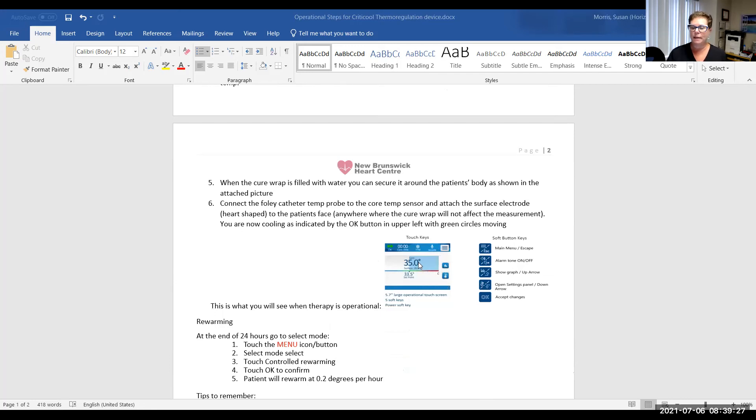When the machine is operational, this is what you will see. You'll see a core temperature, a surface temperature and the set point. Anytime you want to put the machine on standby, you will go and hit the little menu icon and it's the first button.